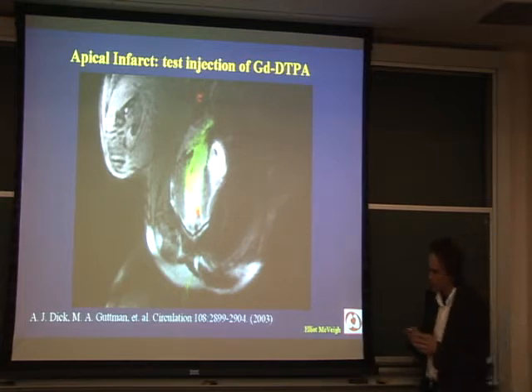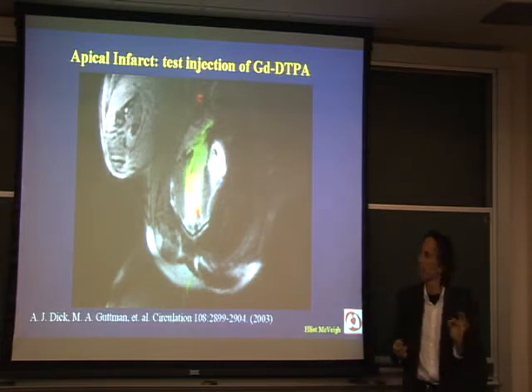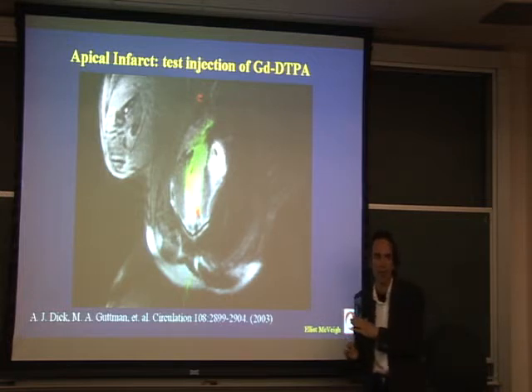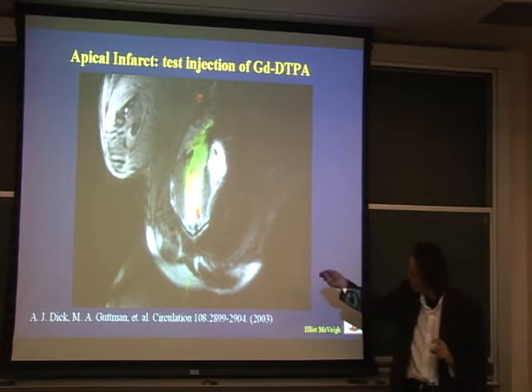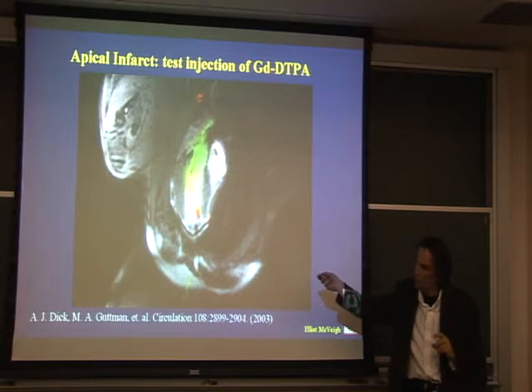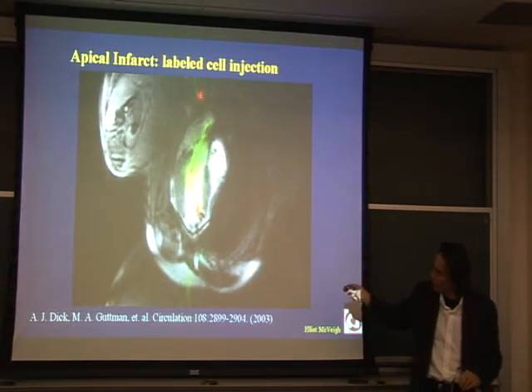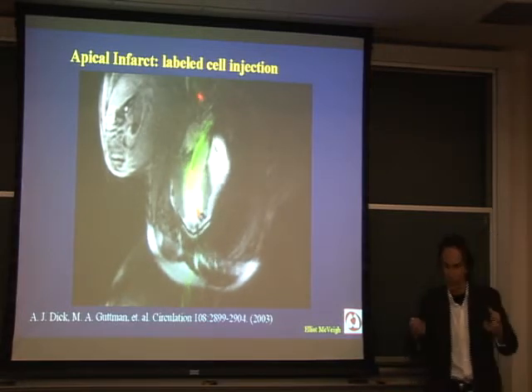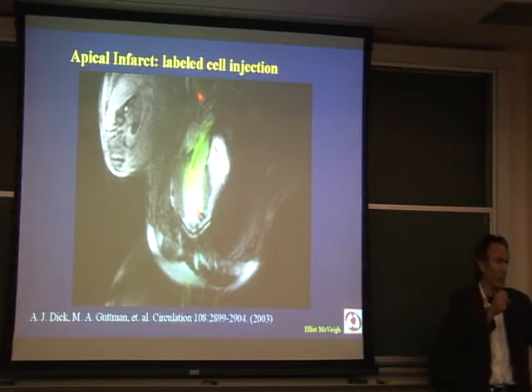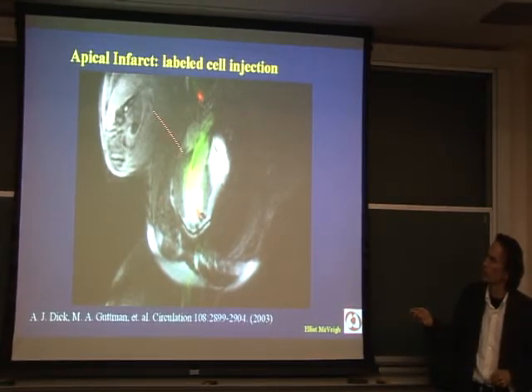And the stem cells are grown up in the medium with little plastic spheres in them called bang particles. And these particles have bits of iron in them, and they also have fluorescence so that you can track the cells at a later time, histologically with fluorescence, and also on the MR. But what I want you to watch is the end of that needle in the myocardium there. As the injection occurs, bang, there's the injection. You can see that there's a very dark spot where that volume of cells has been injected. There's iron that the cells now carry with these particles. They take up these particles, so they have this iron inside them. As they go into the tissue, they create this signal void. So you can see how broad the injection is and where to move the needle to make the next.